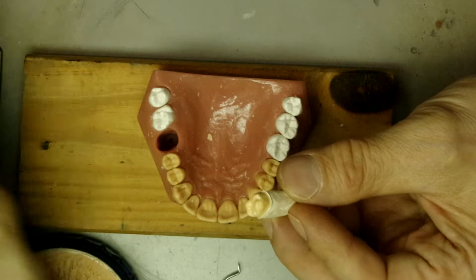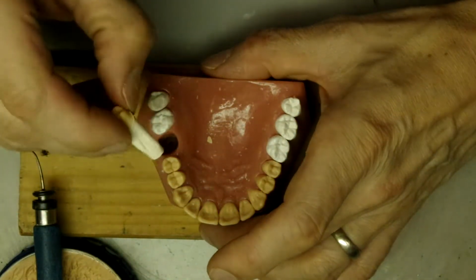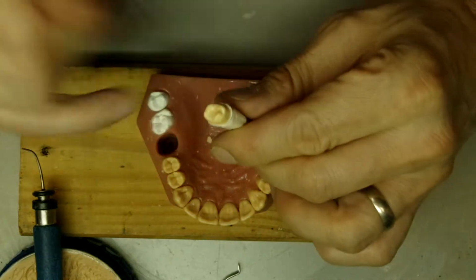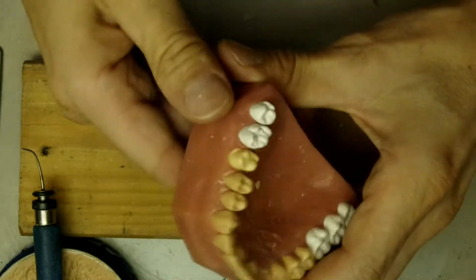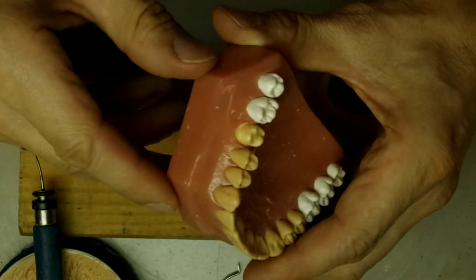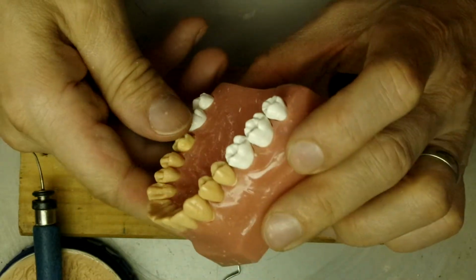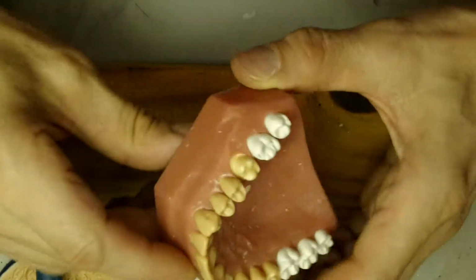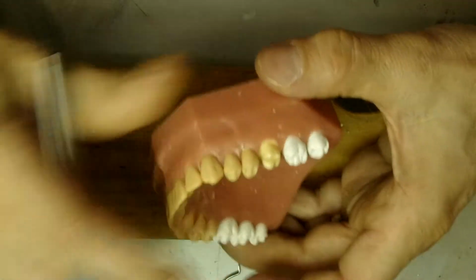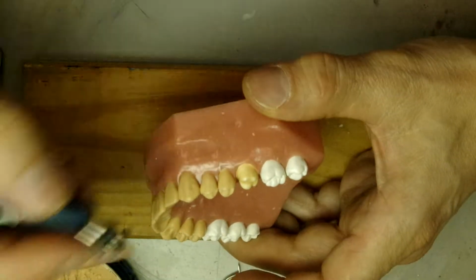Okay, so now we put it back into the model. Make sure that we have the lingual to the lingual, and then we press it down. Make sure it's all the way down. You see how the margin doesn't show at all? So I keep telling you guys, just press it down. This way when you finish waxing, it's not gonna keep popping up.